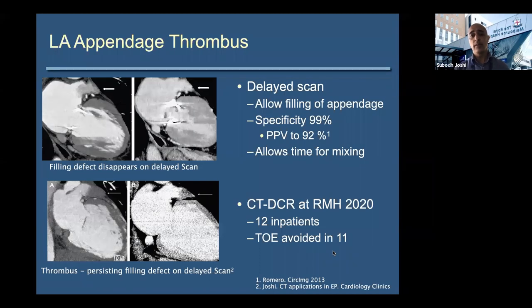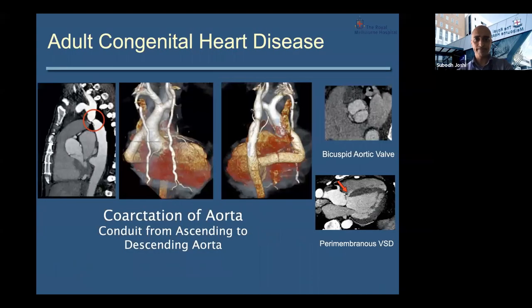And during this year with COVID, we were trying to avoid doing TOEs. So in inpatients, our routine became to do CT instead. And I think we've done about a dozen patients and we avoided TOE in 11 of them. So that's proven quite helpful.